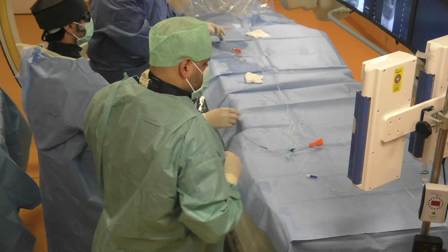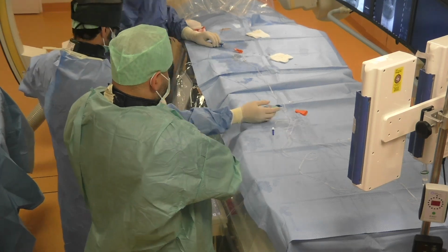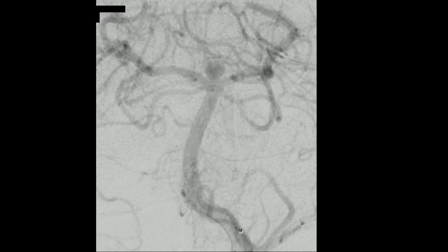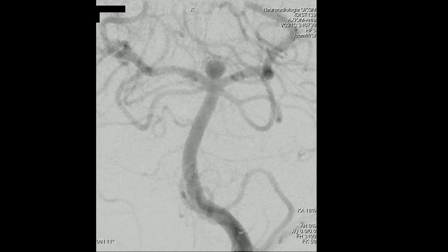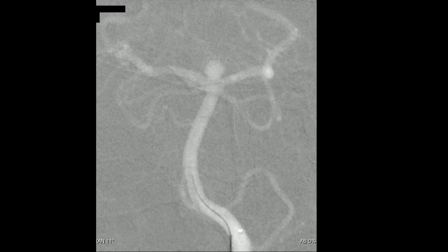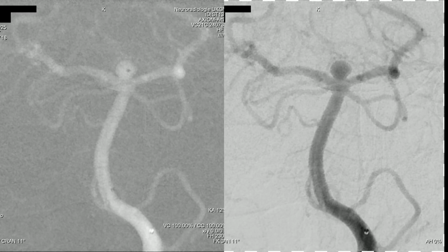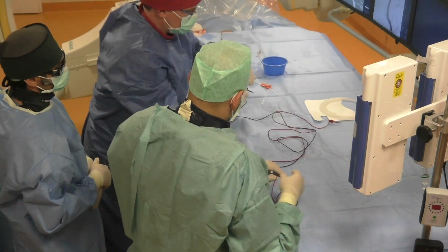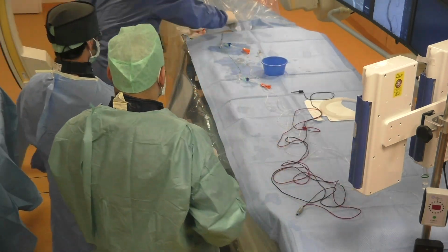And now we take our microcatheter Headway 21 by 156 centimeters. And now we can navigate the basilar artery with the microwire and then with the microcatheter. And now we can push the microwire into the aneurysm sac and then the microcatheter. The tip of the microcatheter is now in the aneurysm sac. And now we can prepare the detachment cables and connect them to the detachment device.